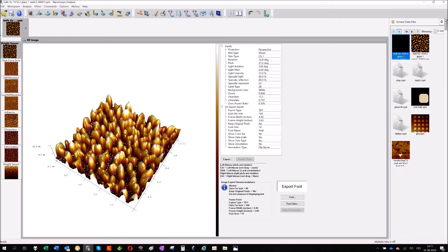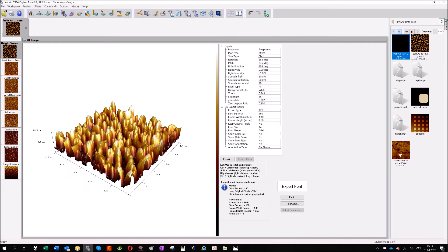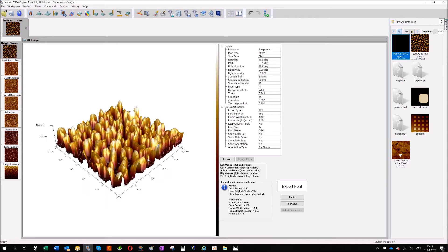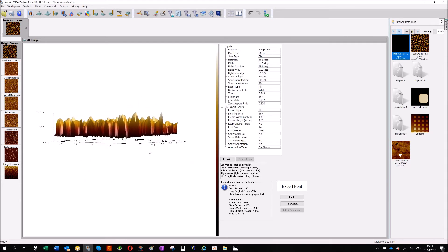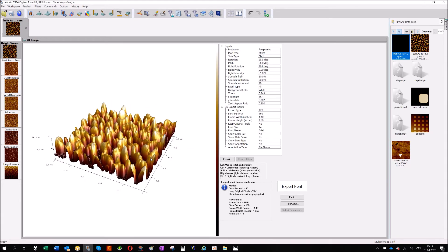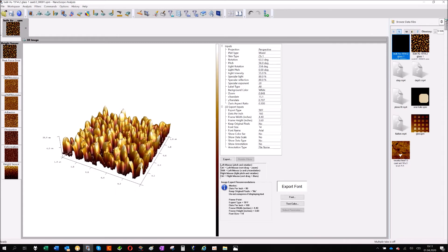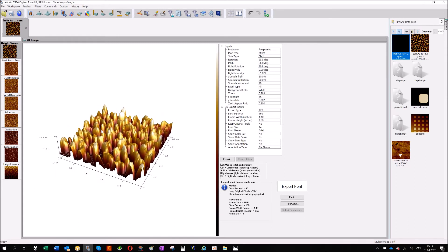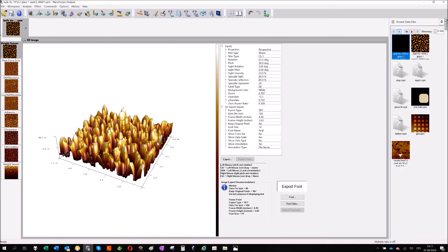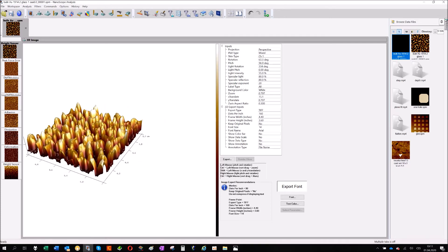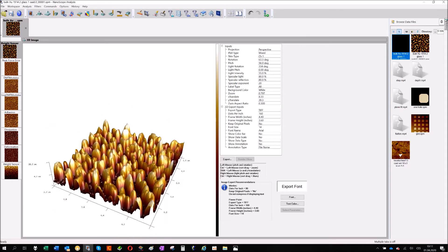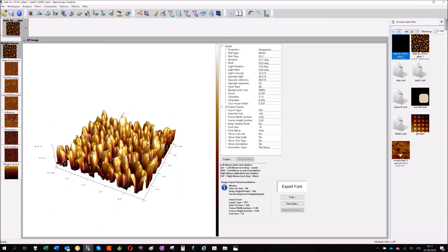So let's start with the left mouse, left button on the mouse and moving, just changing the rotation. If I also click the control button and again left mouse, I'm zooming in and zooming out. With shift and the left mouse, I'm moving in the Y direction.